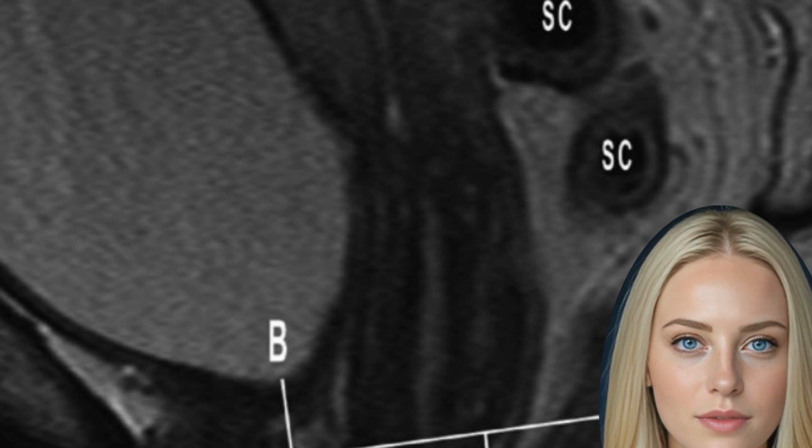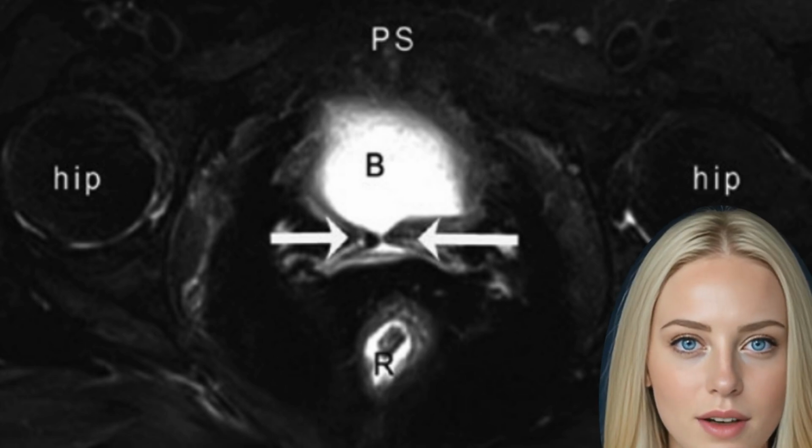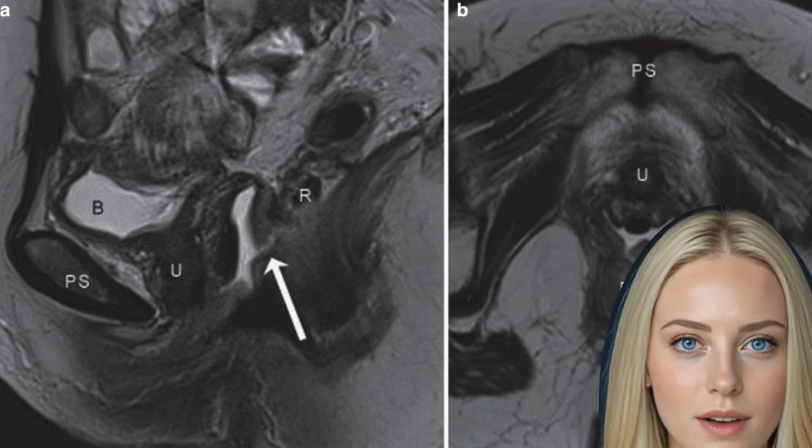This precise description gives an impression of an individual woman's pelvic support in addition to an accurate, observer-independent, site-specific observation of the stability or progression of prolapse over time. Similar judgments are made regarding the outcome of surgical repair of prolapse without interpreting the data.